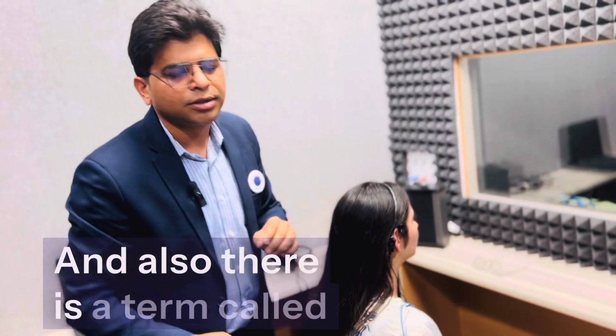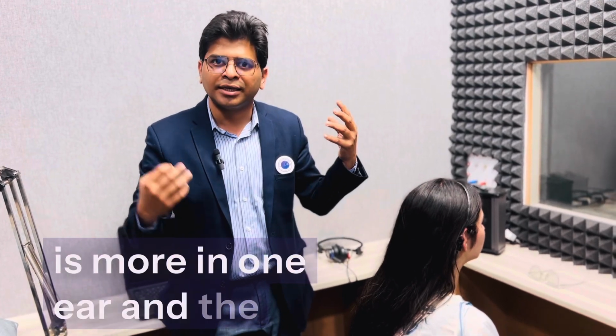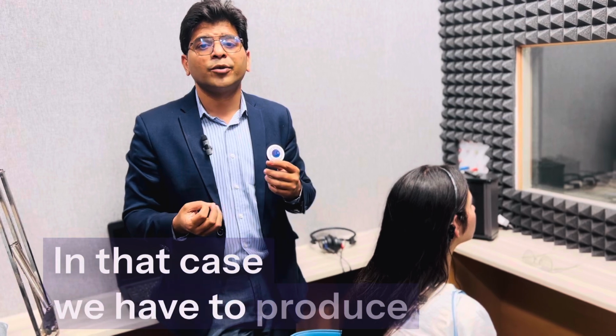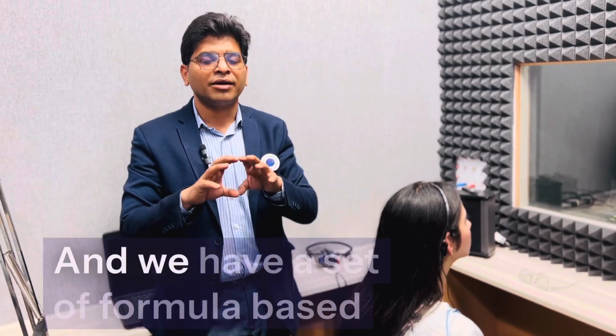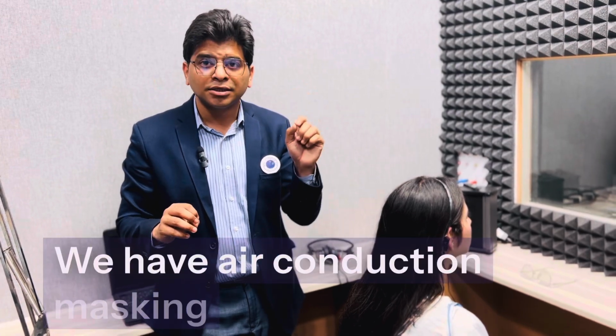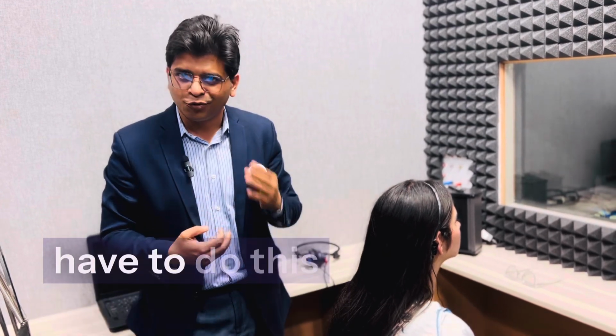And also there is a term called masking, like when there is an asymmetrical hearing loss, more in one ear and the other ear is having better thresholds. In that case, we have to produce the sound, and we have a set of formula. Based on that formula, we do the masking. We have air conduction masking, we have bone conduction masking, and this is actually a little tedious process, but still we audiologists have to do this.